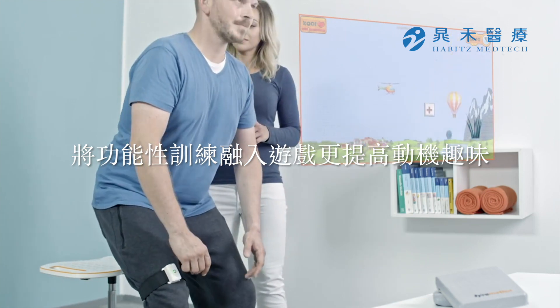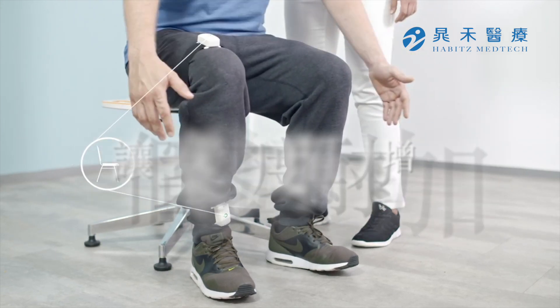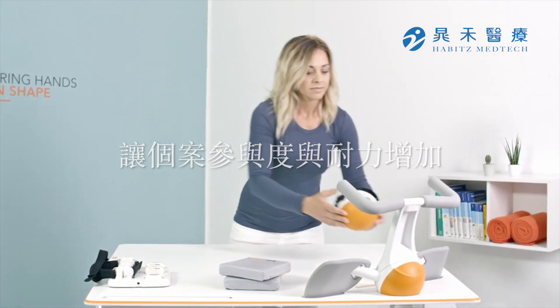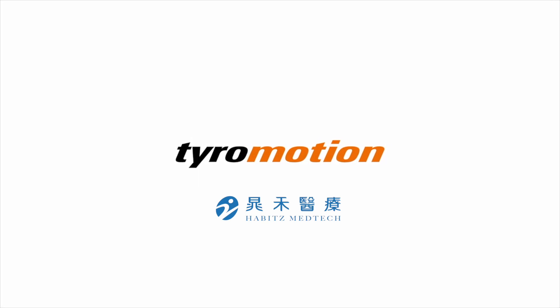Activities of daily life, such as sitting to standing, can be trained with an external focus in a more motivating way. You don't need a table full of therapy devices anymore. The Pablo system enables endless possibilities for the effective therapy and assessment of patients with impaired functions. You have the expertise. We have the tools.